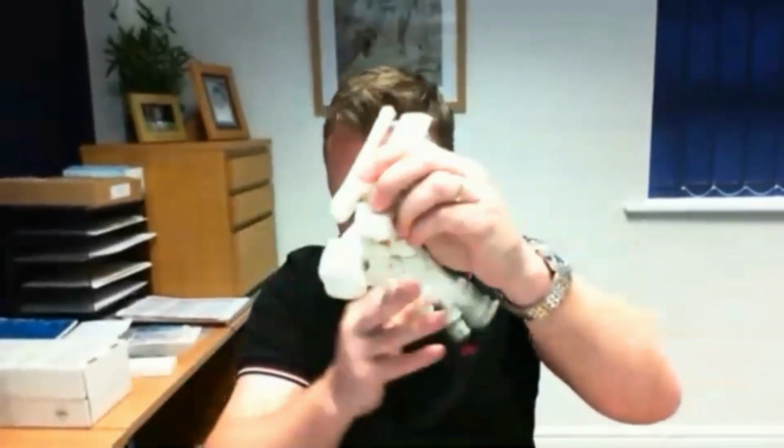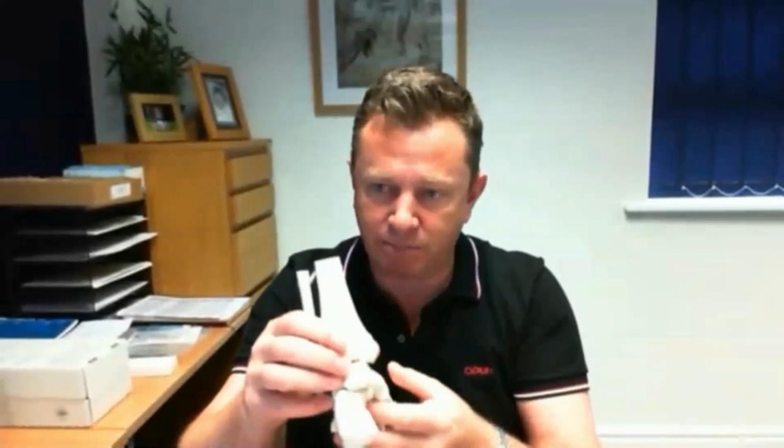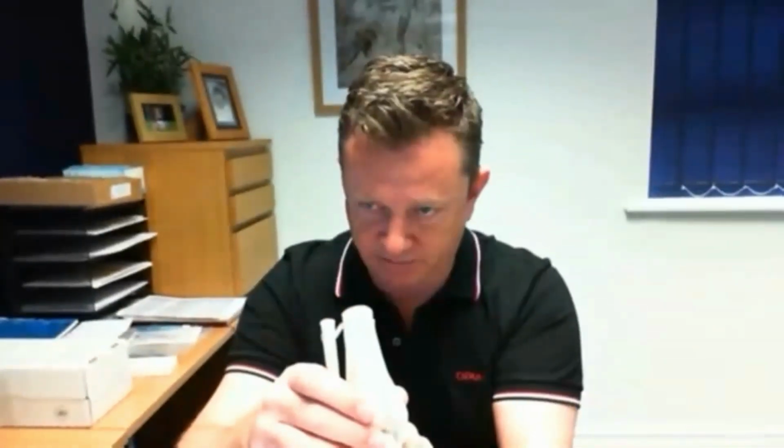Yes, it's really important. Alignment, shank alignment, massively important. Sagittal plane tuning, massively important. But just because you take a structure which is highly complex and wrap it in plastic does not mean it will not move. And I think we need to be thinking an awful lot more about midfoot control and about forefoot position when we're designing AFOs than we do in the heel.